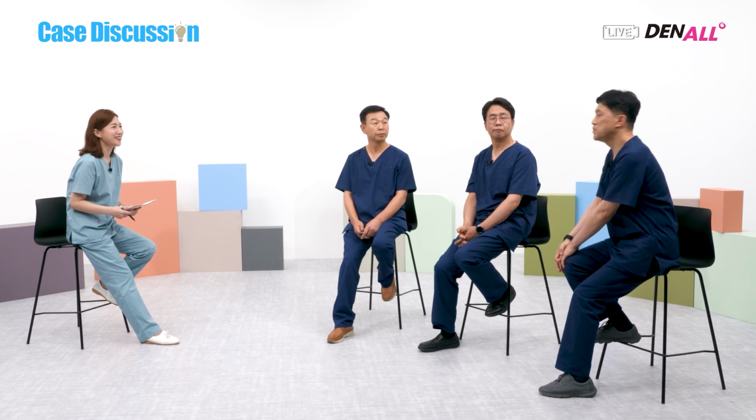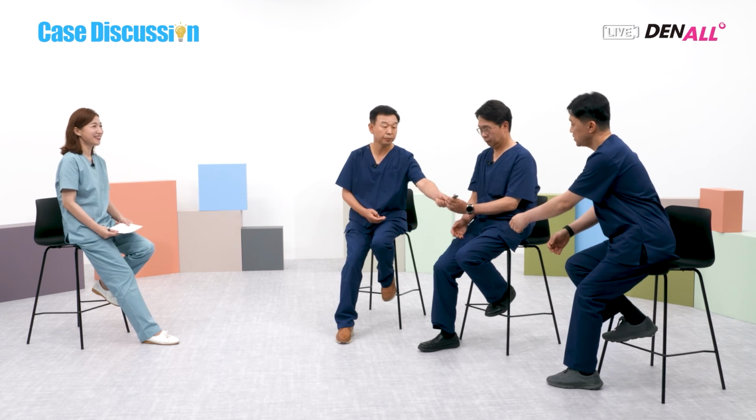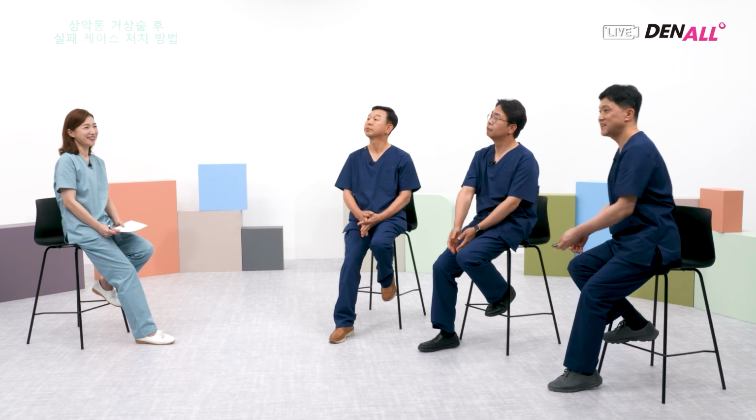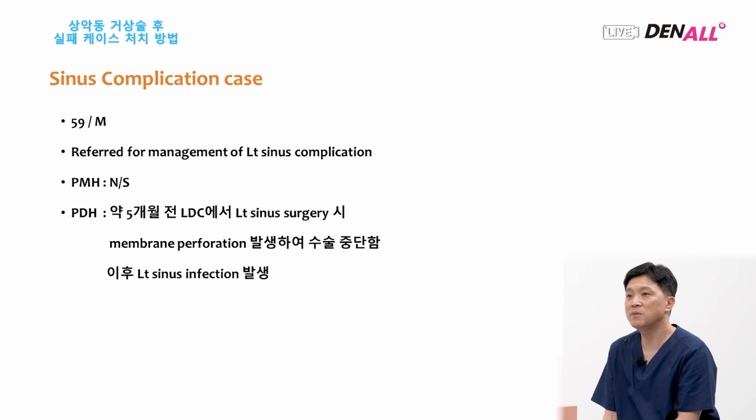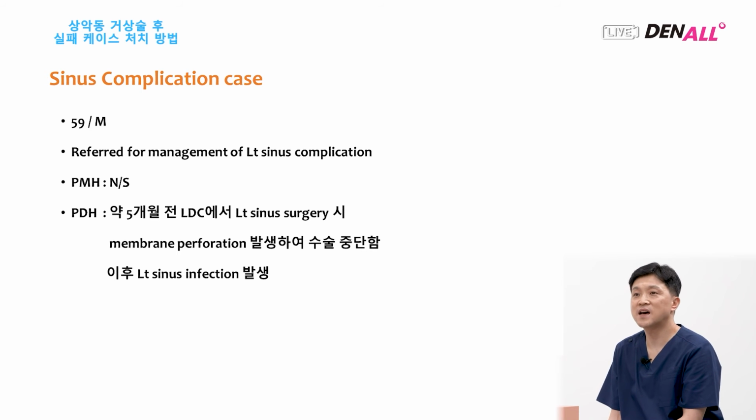Dr. Son? I have prepared a similar case of my patient, a 59-year-old male. Five months before, sinus surgery was performed by another dental office, and a membrane perforation occurred, so surgery was stopped, and the patient was referred to me due to a left sinus infection.